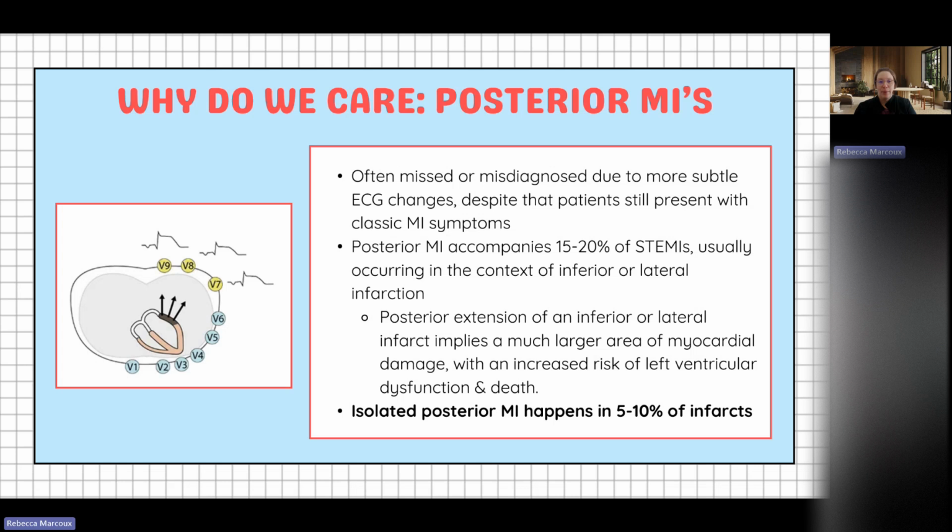And then why do we care about posterior MIs? The thing with posterior is they're often missed. They can be missed or misdiagnosed due to more subtle ECG changes, despite that patients with posterior MIs will still present with classic MI symptoms. So as I said before, posterior MIs accompany up to 15 to 20% of STEMIs, usually occurring in the context of inferior or lateral infarctions.